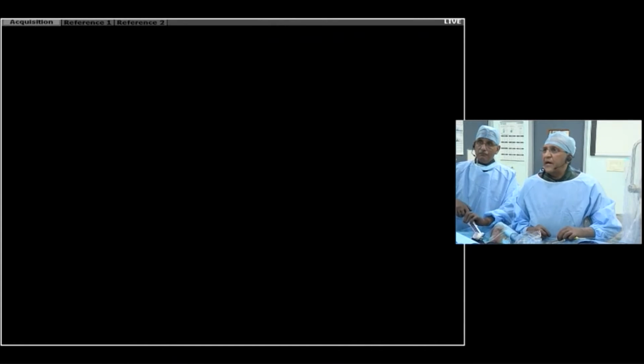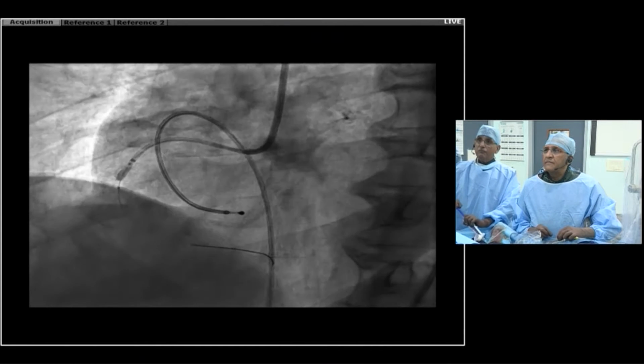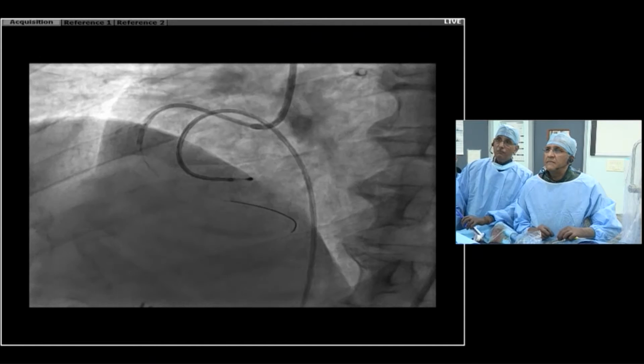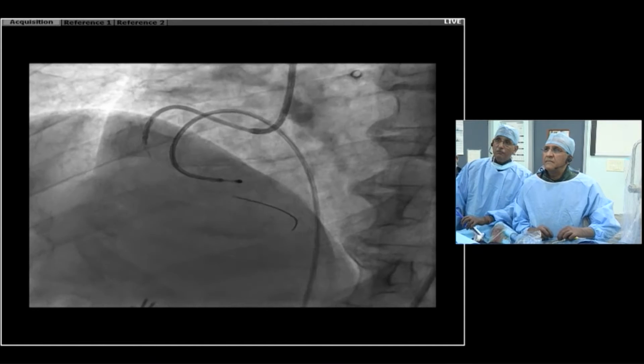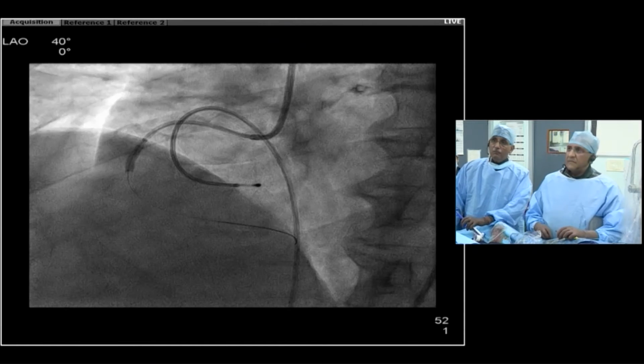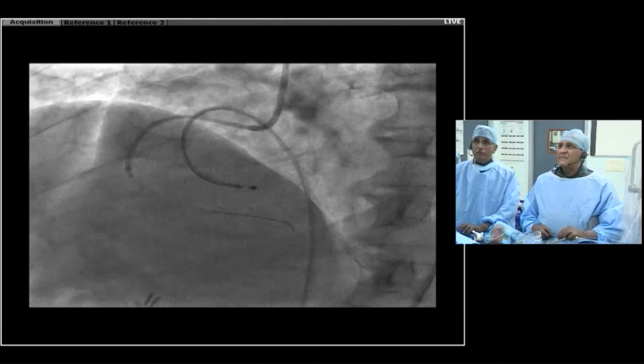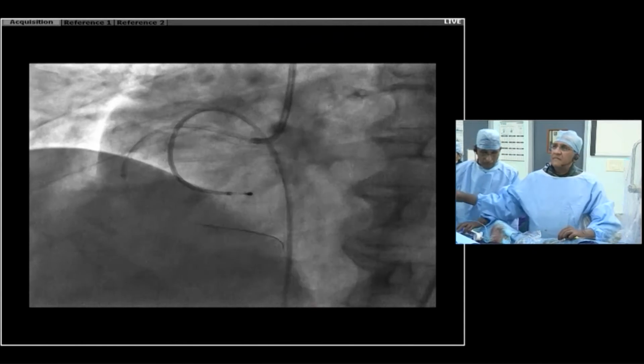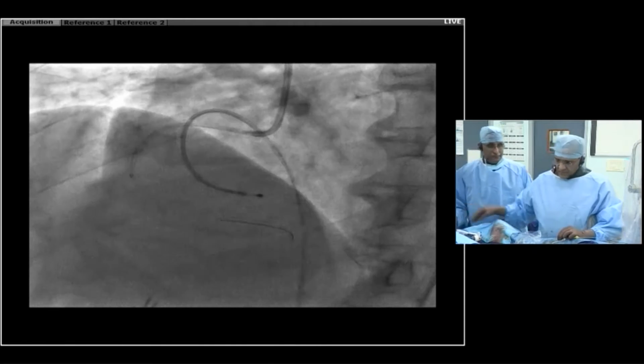Okay, go down slowly. I have the impression there is a proximal part of the balloon that's not perfectly open. But the guide extension goes down, so I think you certainly did better. That maneuver is good to see if your stent's going to cross. It's also good in case you have some problem, you can seal it that way.